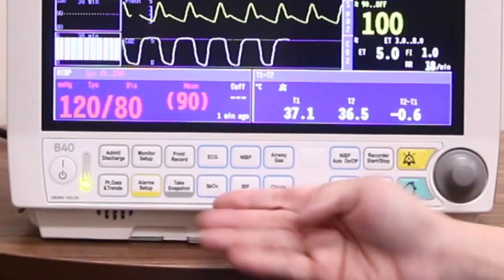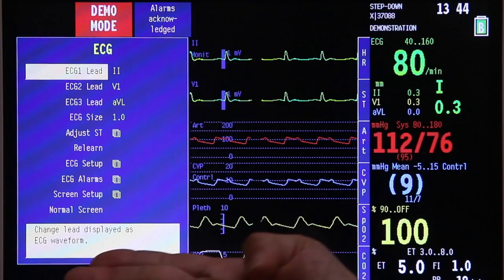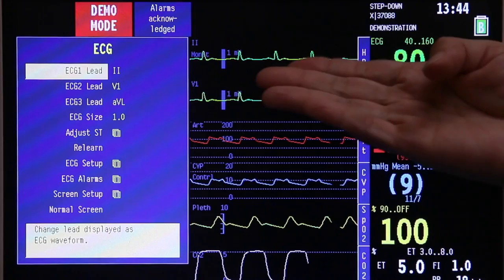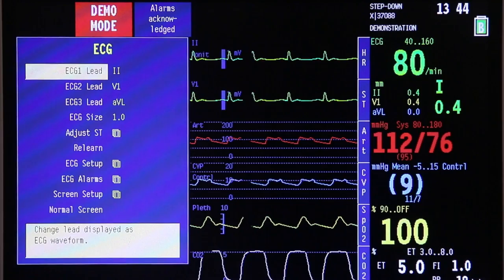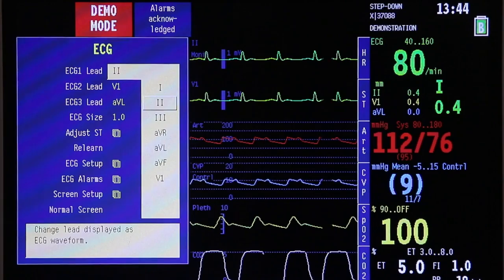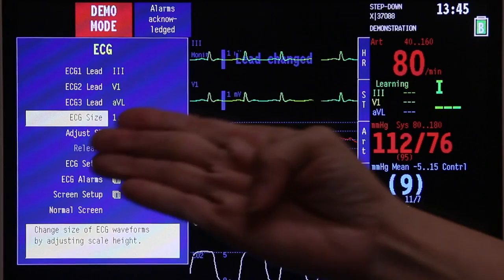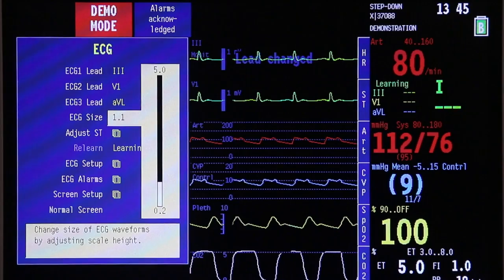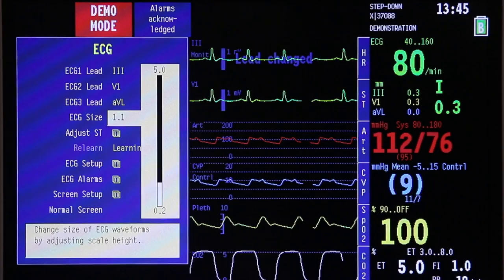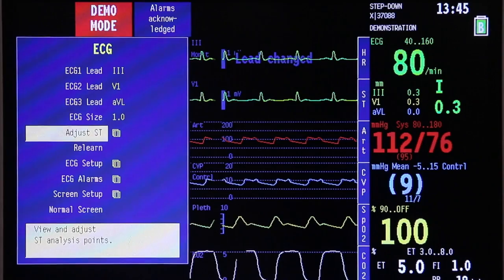The ECG menu is accessed by selecting the ECG key on the command key panel. Once you press that, it will bring you to the ECG page where you can adjust the leads you want to monitor on ECG leads 1, 2, and 3. Press the trim knob and scroll up or down to the selected lead that you want, then press once to enter it for that specific ECG lead. You can also adjust the ECG size by pressing the trim knob and scrolling clockwise or counterclockwise until you reach the desired size, then press once.